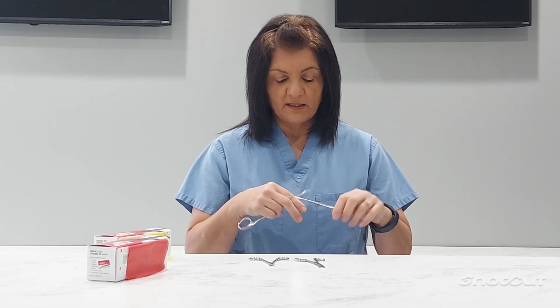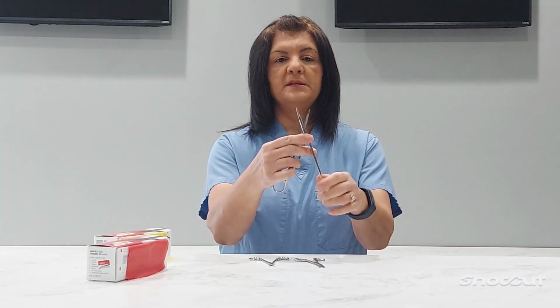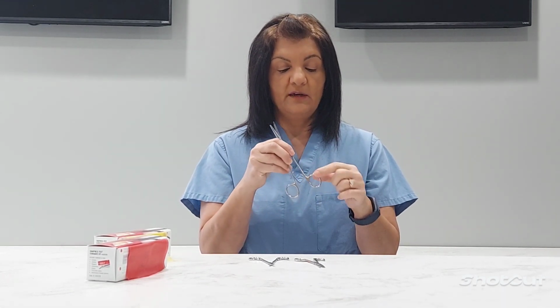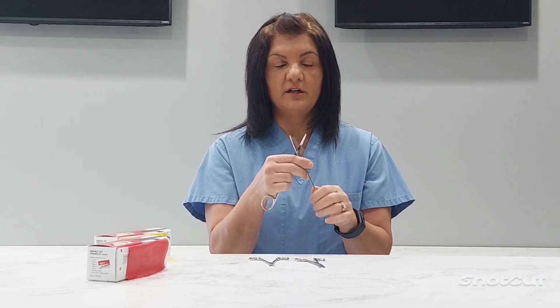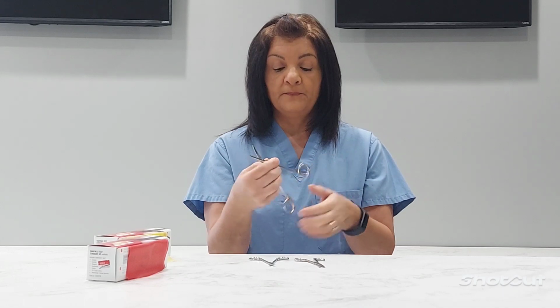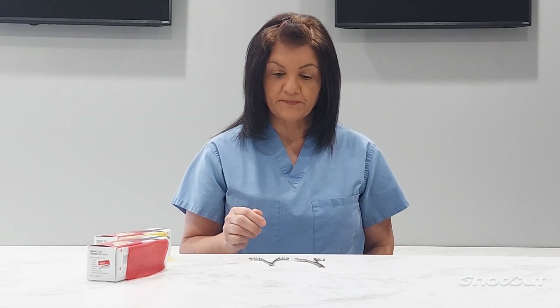So I'm looking at the lockbox. I'm looking for those things. Not seeing really too many on here. However, I am seeing that this one is missing the entire tip. So that is a no-go. I do want to point out that this one does have gold handles, which means that part of this scissor blade is made out of tungsten carbide, which makes it a harder cutting surface. So if any of your docs are asking for the specific gold-handled Metz scissors, that's why they want that specific cutting surface for whatever it is they're doing. So obviously, missing a tip is going to go in my repair bin.